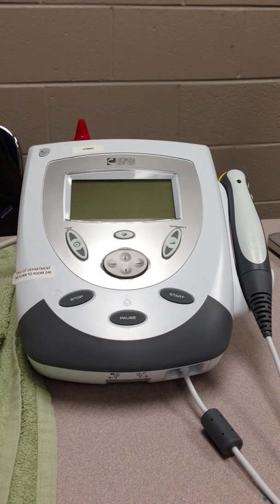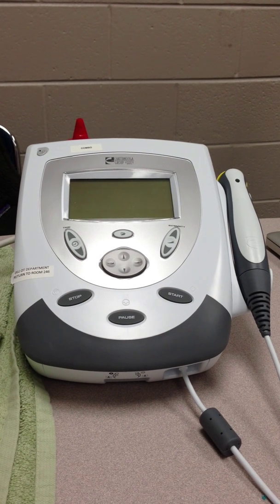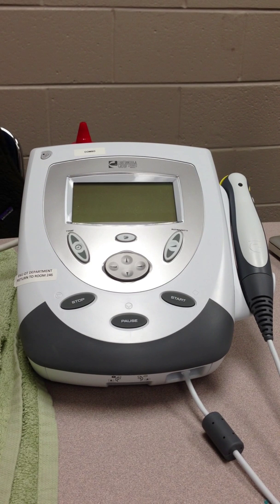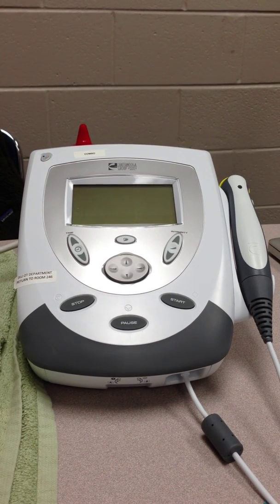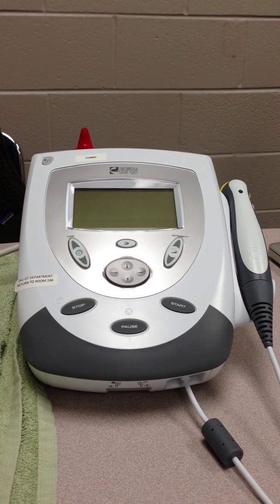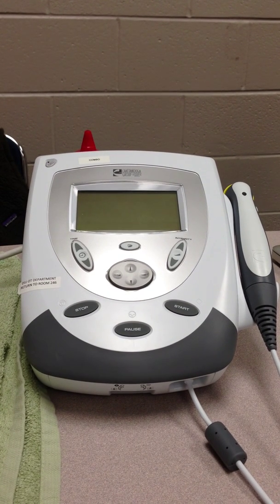Select appropriate frequency range. Waves of 3 MHz are more appropriate for shallow targets, while waves of 1 MHz are appropriate for deeper targets. Apply medication and carrier to the skin as the coupling medium or under the coupling medium. When using conductive gel or glycerol contact coupling, apply thin layer to clean skin. Too much will diminish transmission.